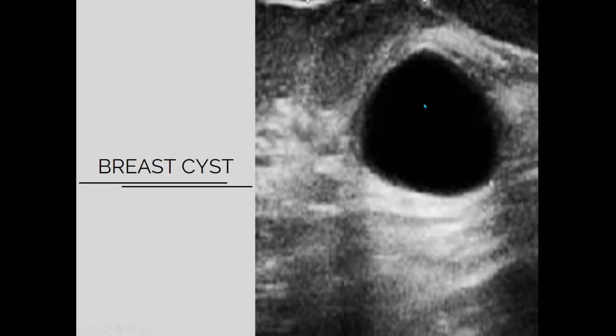Actually, when we are giving you such investigations in which you cannot say which part we have imaged, in that case we provide you a scenario. Naturally, if you give me this picture, I cannot say which part it is.